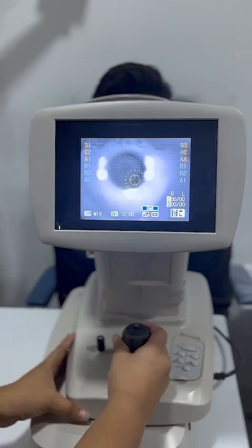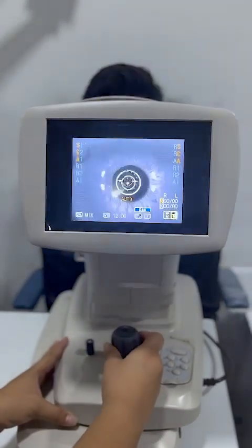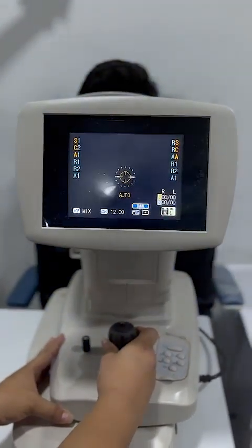Since it is auto focus, I will show you — it takes three readings at once automatically.